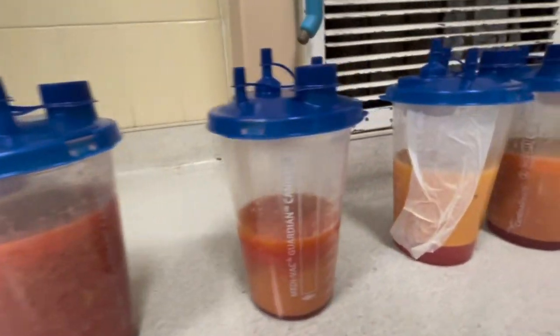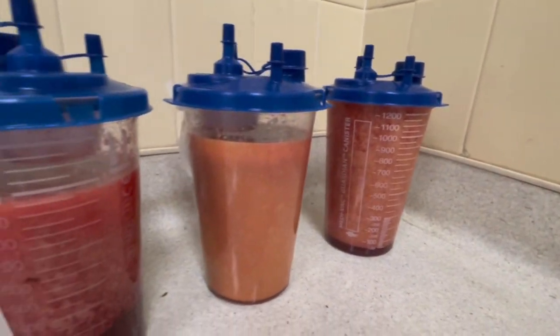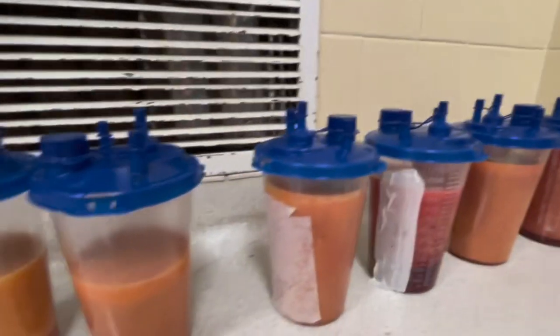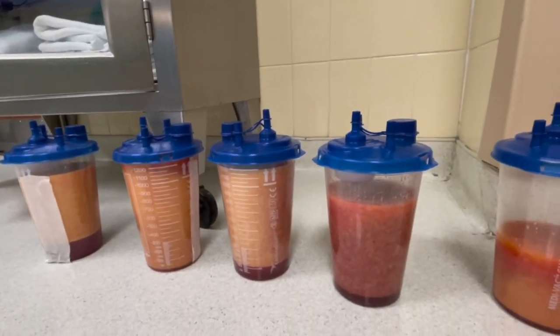This is what we got. You can see the colors are different — some are a little bloodier, some not. That's what stops us from taking more. But overall the quality of the fat is actually pretty nice.